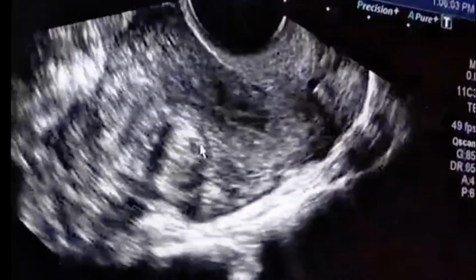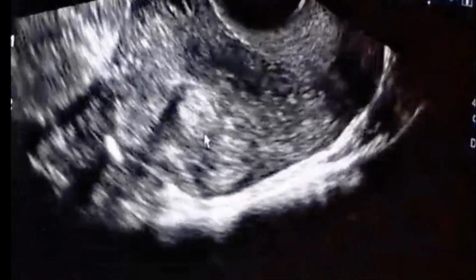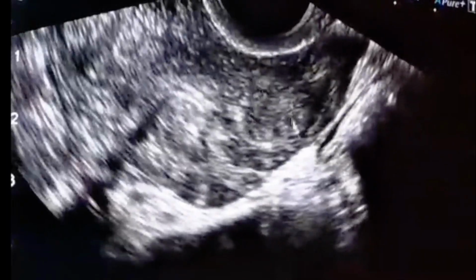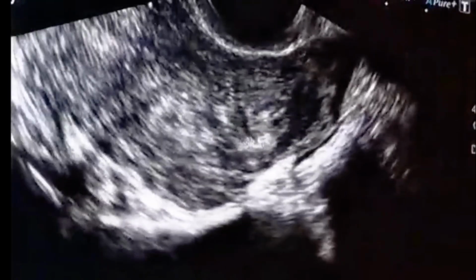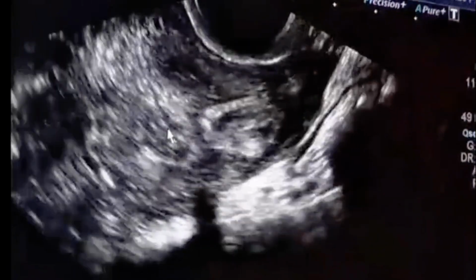These are fibroids. These are not important. This one is rounded echogenic, and the other one is this one. This is also echogenic, but not so important, and this does not cause any infertility.